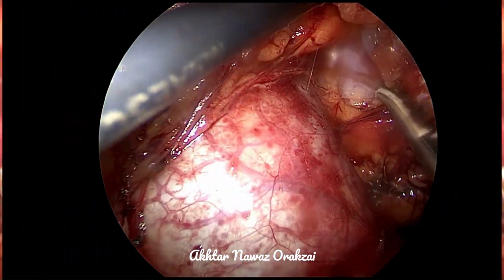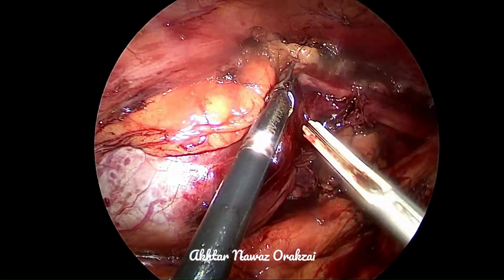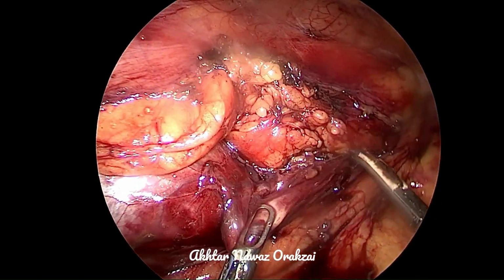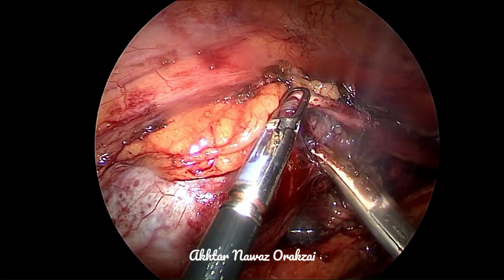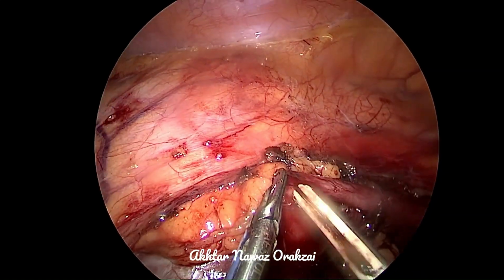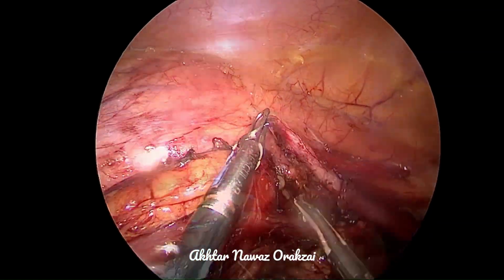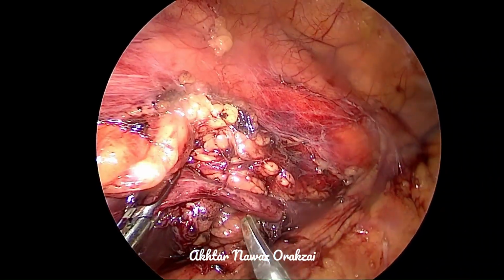So the segment on which we will work is complete now, and you can see the lower pole parenchyma of the kidney. Now I'm denuding this area just to demonstrate that yes, obstruction was there. So I denuded this portion, number one. Number two, a little bit of denudation will happen, because if we don't dissect that tissue, that may hamper the reconstruction of the segment. So you can see that there is narrowing. However, the PUJ is quite low. We can see that if we resect it, it can reach easily without tension.